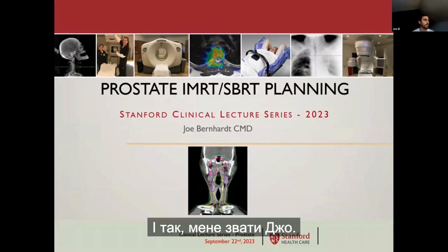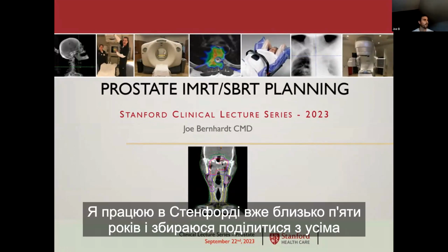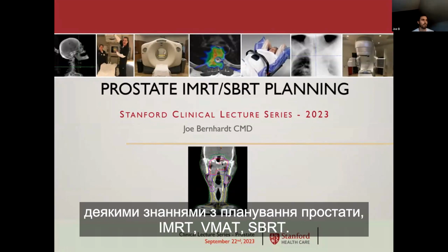And yeah, my name is Joe. I'm a dosimetrist with the team. I've been with Stanford about 5 years now, and I'm gonna share some prostate, IMRT, VMAT, SBRT planning knowledge with everyone.